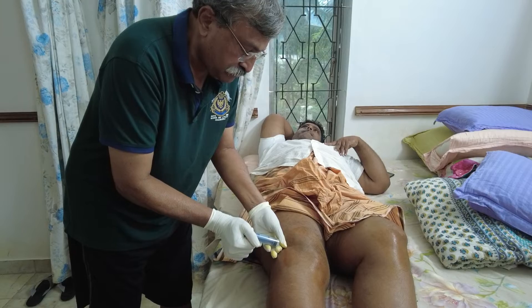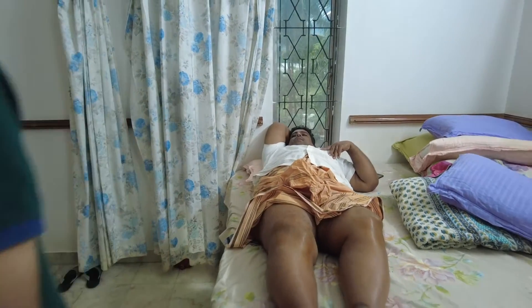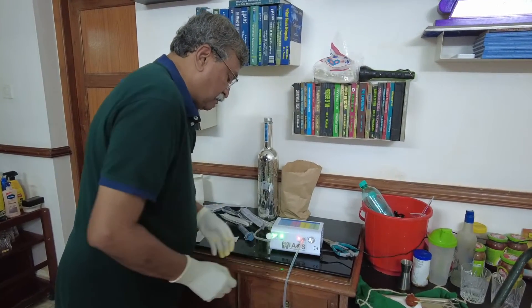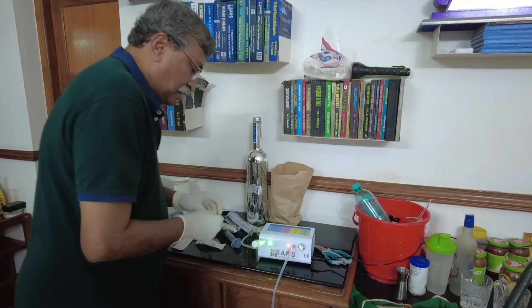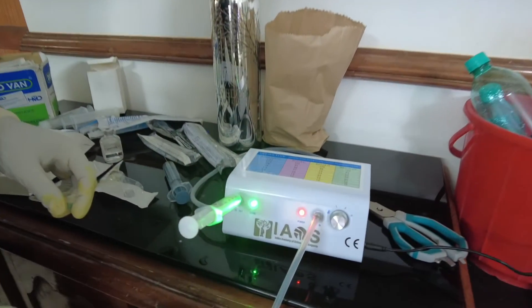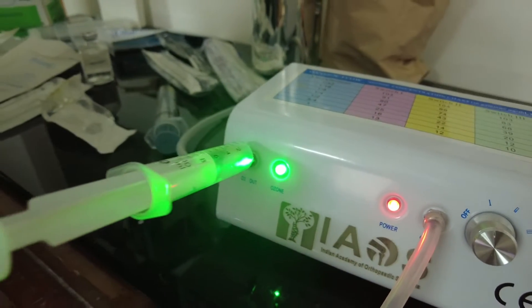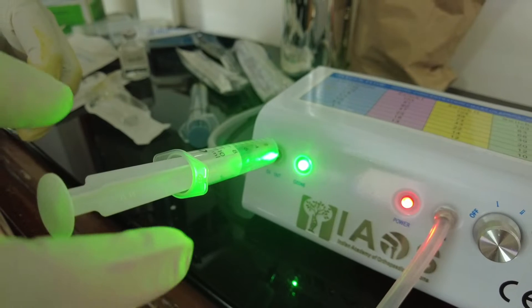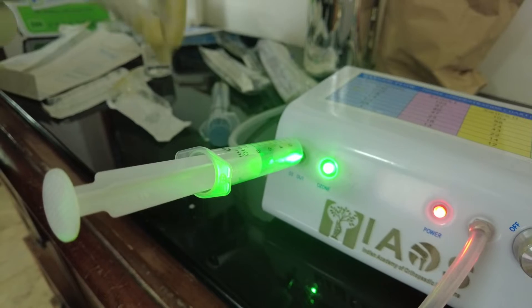We now go to the ozone machine. Once we switch on the appropriate concentration and click the syringe to the machine, ozone will come out and gradually push out the plunger at the desired concentration, which in this case is 70 micrograms per milliliter.